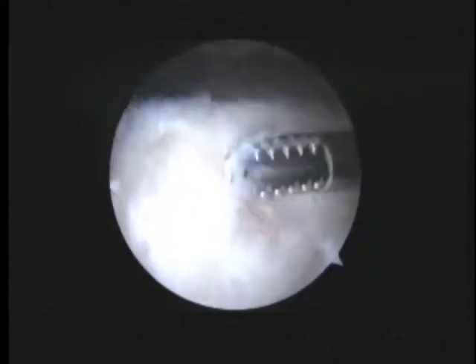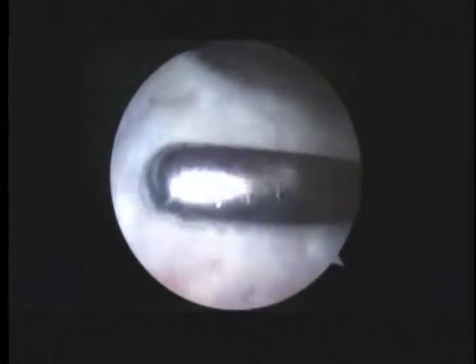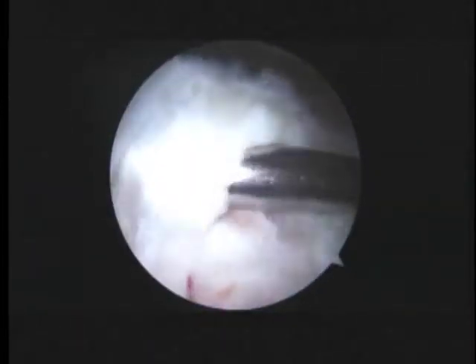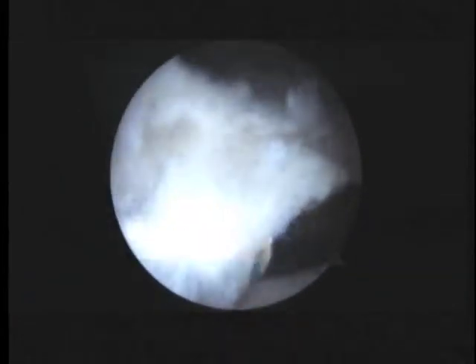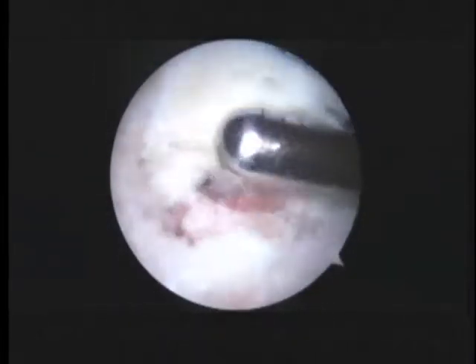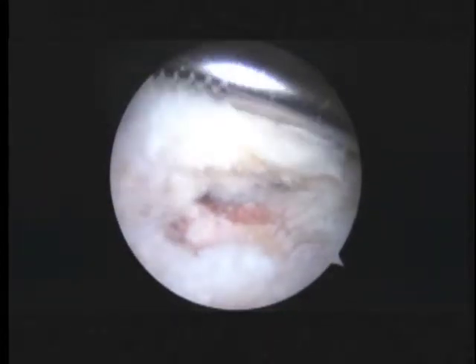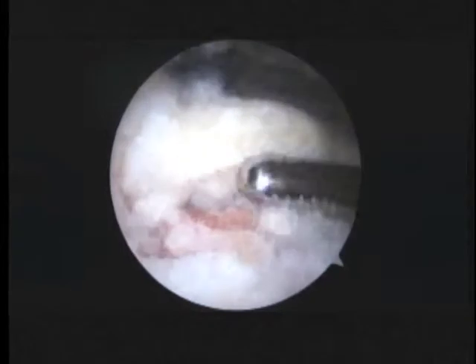So let me stop the shaver. So all this stuff is not good tendon. You can see how it's torn. And we're just going to open that up so we can fix it properly. See how that just lifts right up there? So just for orientation, anterior is to the left, you can see the biceps tendon just under there. This is a small anterior tear in the supraspinatus tendon.